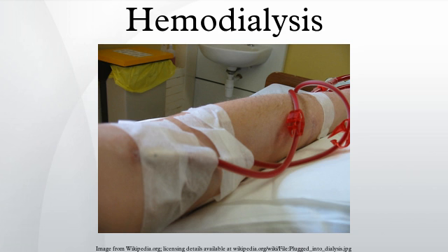There are two ways of reusing dialyzers, manual and automated. Manual reuse involves the cleaning of a dialyzer by hand. The dialyzer is semi-disassembled, then flushed repeatedly before being rinsed with water. It is then stored with a liquid disinfectant, PAA, for 18+ hours until its next use.